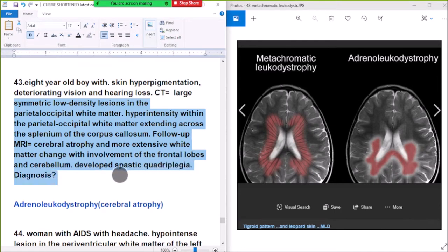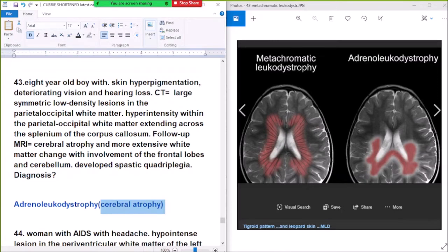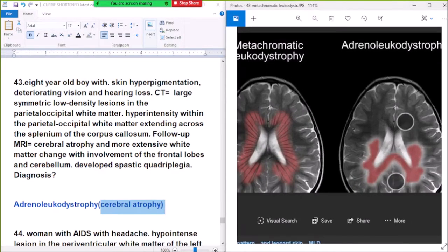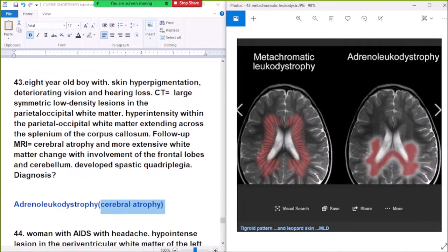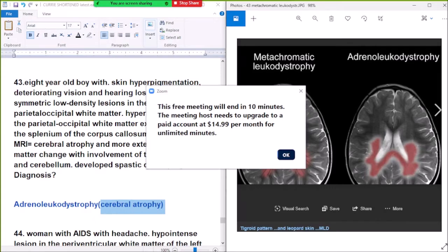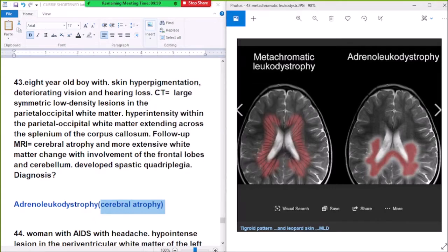Follow-up MRI shows cerebral atrophy and more extensive white matter change with involvement of the frontal lobe and cerebellum, and spastic quadriplegia. Diagnosis: adrenoleukodystrophy with cerebral atrophy. This pattern is called the leopard skin sign, and the other is called the Tigroid Pattern in Metachromatic Leukodystrophy.